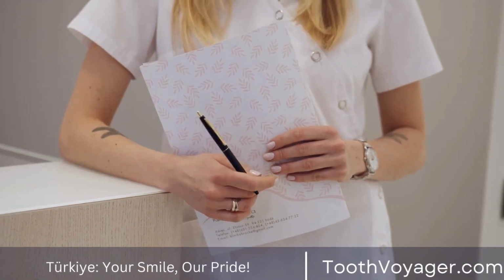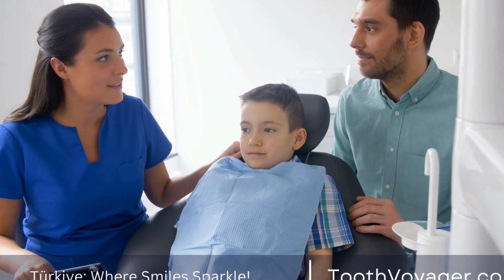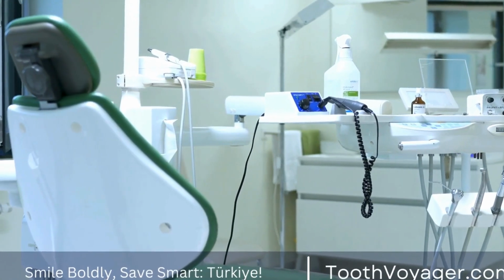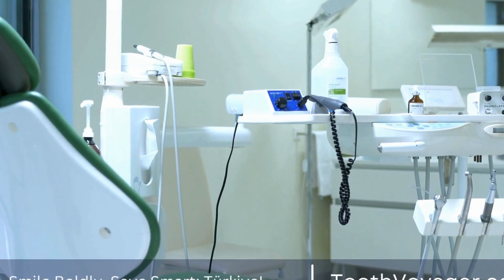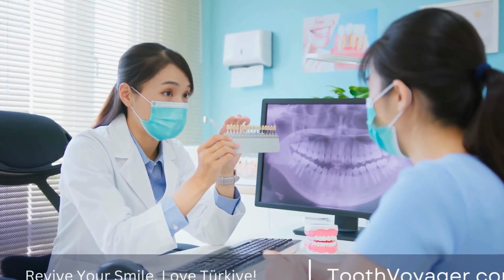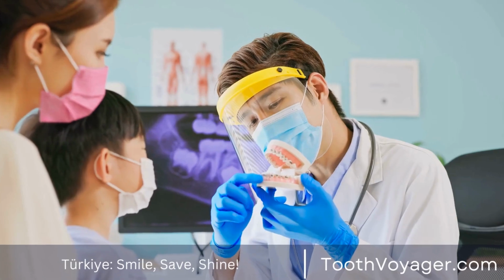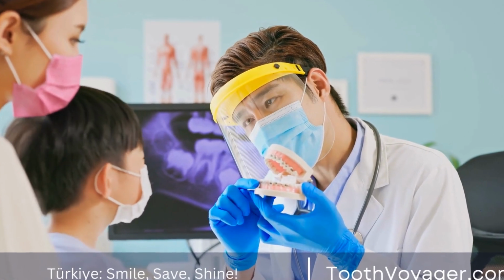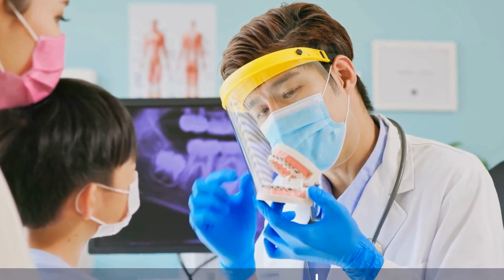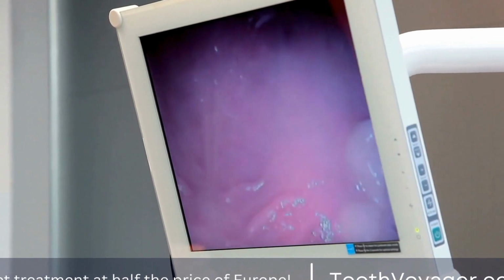How is dental bonding done? The initial step of the dental bonding process is to prepare the tooth. The process involves roughening the tooth's surface by applying a conditioning solution so the resin adheres to the tooth. When the tooth has been cleaned, the dental professional will then apply the resin onto the tooth and shape it according to the desired dimension and shape. When the resin is in place, the dentist uses a special light to firm and bond the substance with the tooth. When the resin is hardened, the dentist can mold and polish it so that it appears natural.